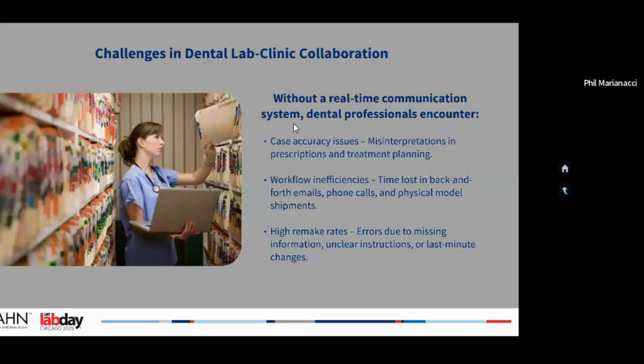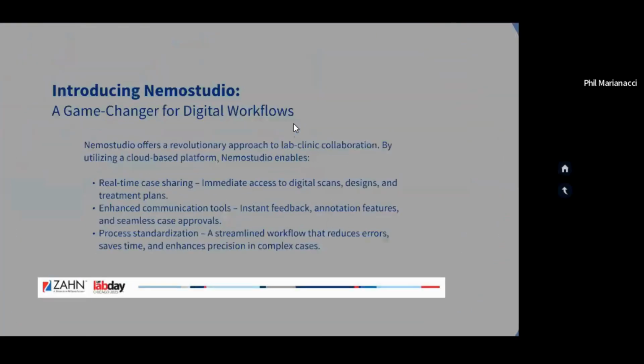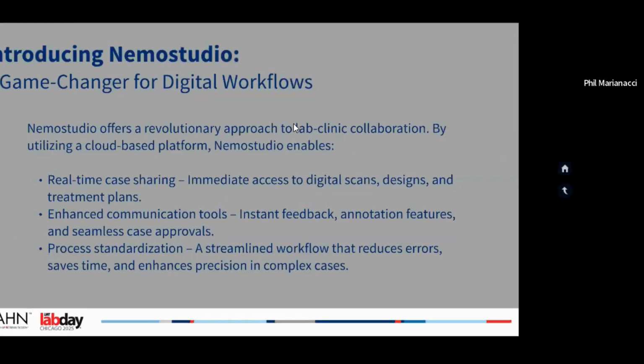And so, you know, between having physical model shipments and the delays in there, the doctors can put the information in instantly. And sometimes, let's say it is a traditional case, we can start working on things. We can get ready for things while that shipment is being shipped. So reducing errors, super important as a dental lab owner or a technician.